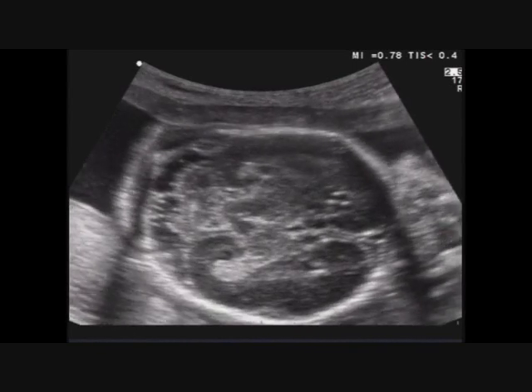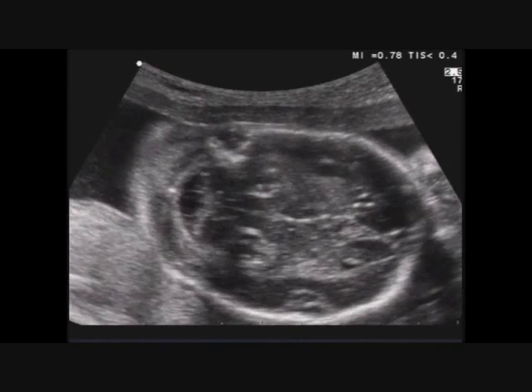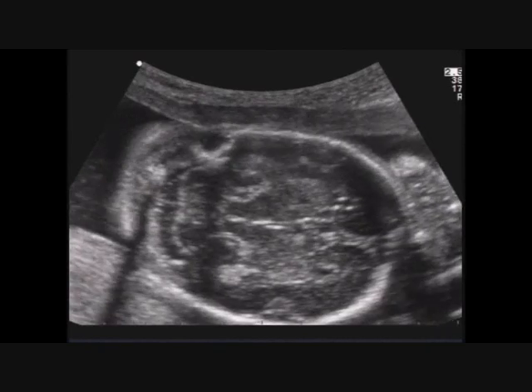And here you can see the principal sign, the absence of the cavum septum pellucidum. In this malformation you can see also migration defects, and for this reason at 20 weeks you can see the insula.